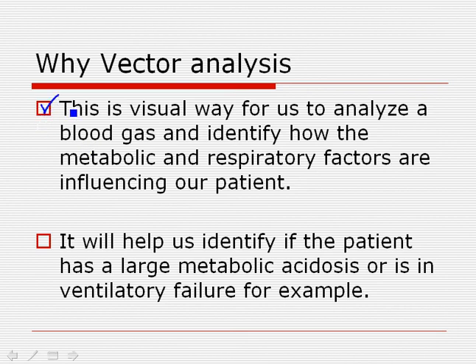So why study vector analysis? Because this is a nice visual way for us to analyze a blood gas. We're going to identify both the metabolic and respiratory components or factors that are influencing our patient, and we're going to come up with a classification system that we understand. It'll help us identify the patient who has a large metabolic acidosis or is in ventilatory failure, for example.